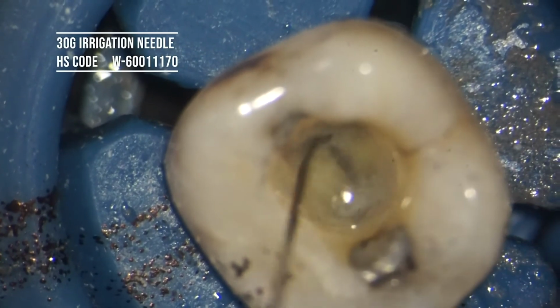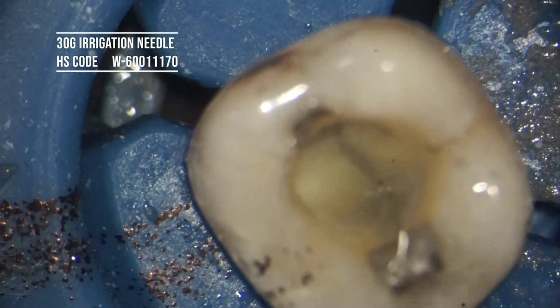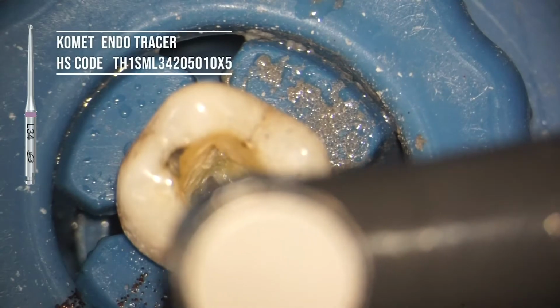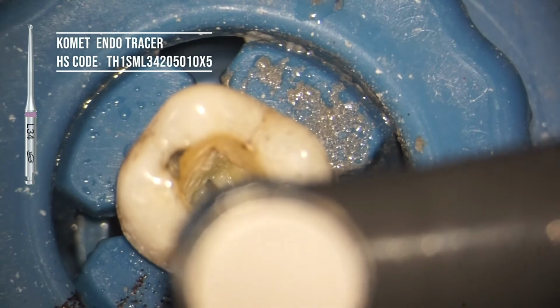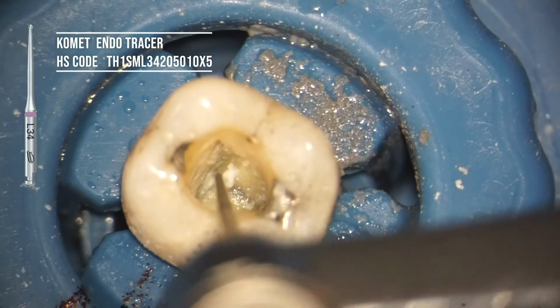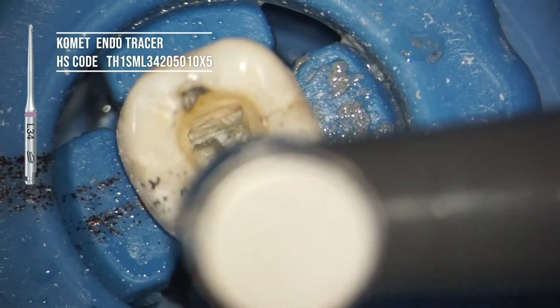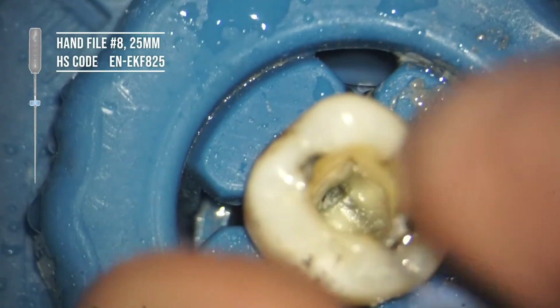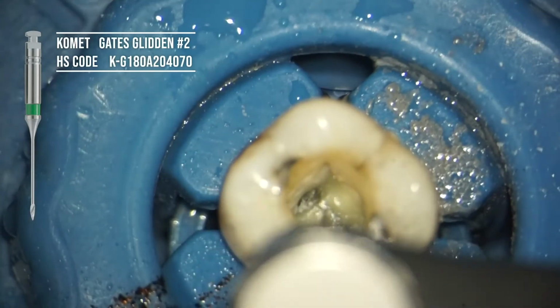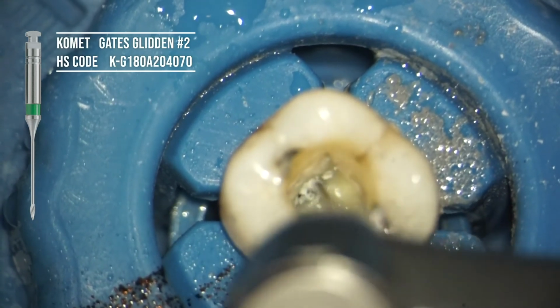Irrigating with a 30 gauge needle, always use a 30 gauge needle. And there we have our access prep. And just refining now into the canals using an endo tracer, because I know that that's a very slender opening. Once again, this is told to me from the CBCT. And I'm just opening up here so I can start to get a little bit of straighter line access, exploring the canal system, which is very tight on the buccal, and not so bad on the lingual. I'm just brushing a tiny little bit of pericervical dentine here away, not too much, just getting a little bit of access into that canal.